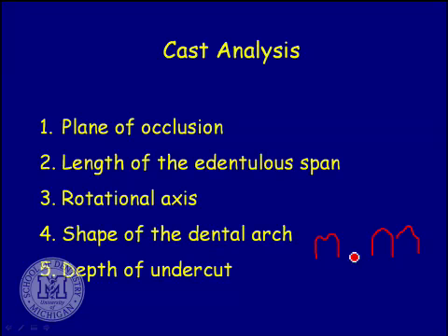Let's say I've got a similar case, molars the same way, I'm missing a first molar, I'm missing a bicuspid, I'm missing a bicuspid, I'm now up to a cuspid. And I'm planning on seating here and then arcing things down here. Can people see that the longer the span gets this way, as this thing arcs forward, I need less blockout on the distal of this tooth with a longer span than I do with a shorter span?